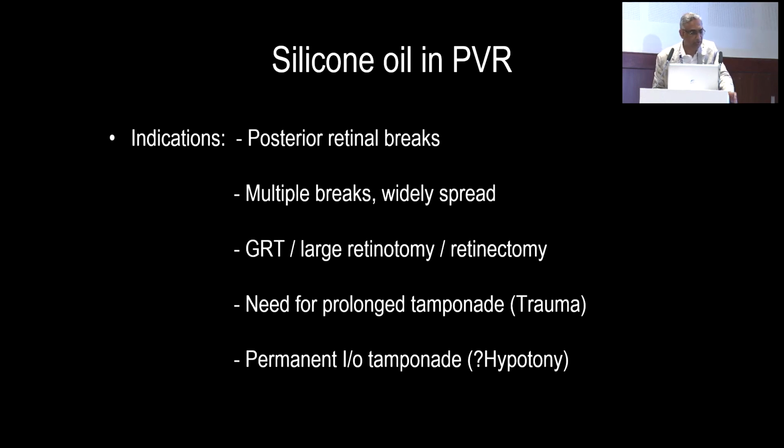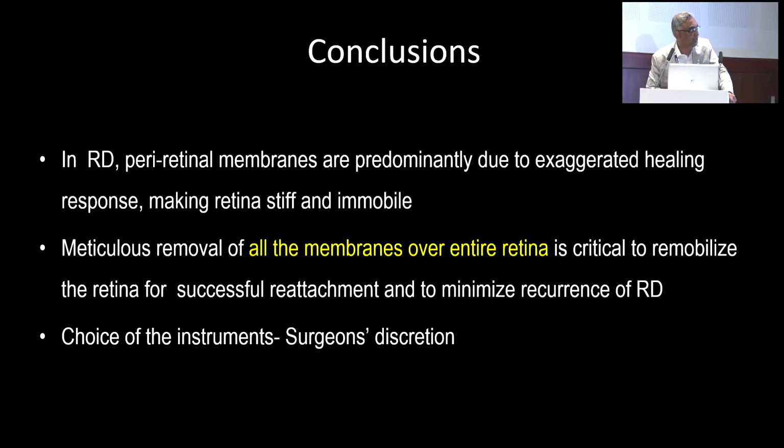Silicone oil, obviously, most of these eyes will eventually end up in silicone oil, unless they are superior isolated breaks and you get enough clear mobile retina. You may be able to get away with gas, but most of these eyes will need silicone oil.